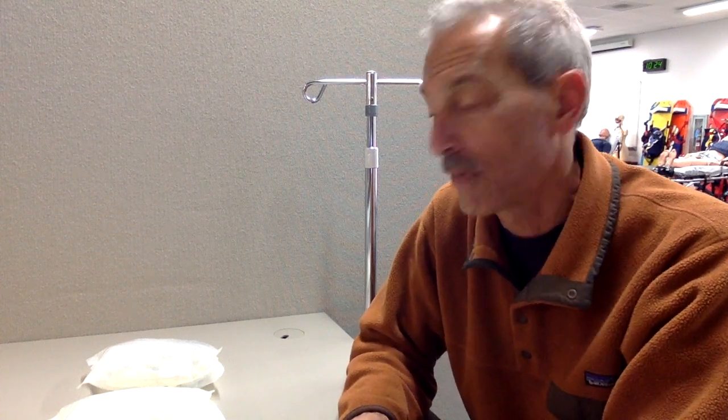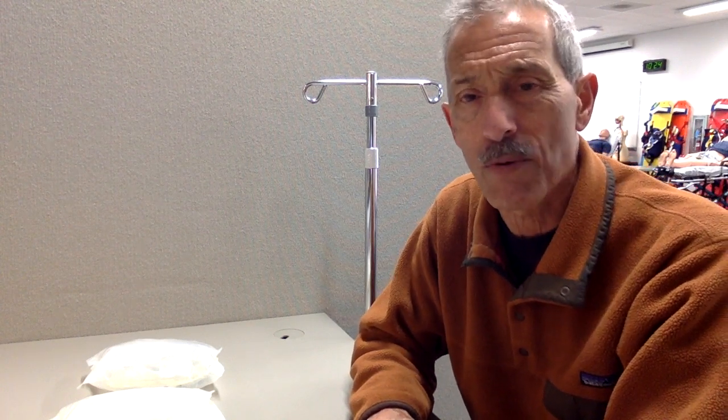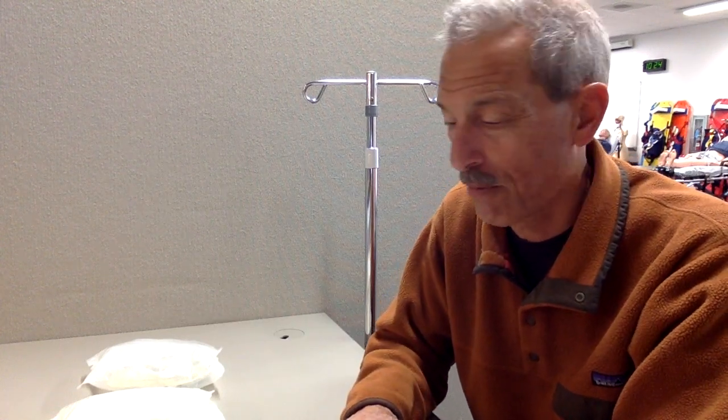Hi there, this is John, your instructor. I wanted to give you a brief demo on how to spike an IV bag. More than likely, if you work as an EMT out in the field, you're going to work with a paramedic and they're going to ask you to spike an IV bag for them to prep the patient for whatever kind of treatment there might be.